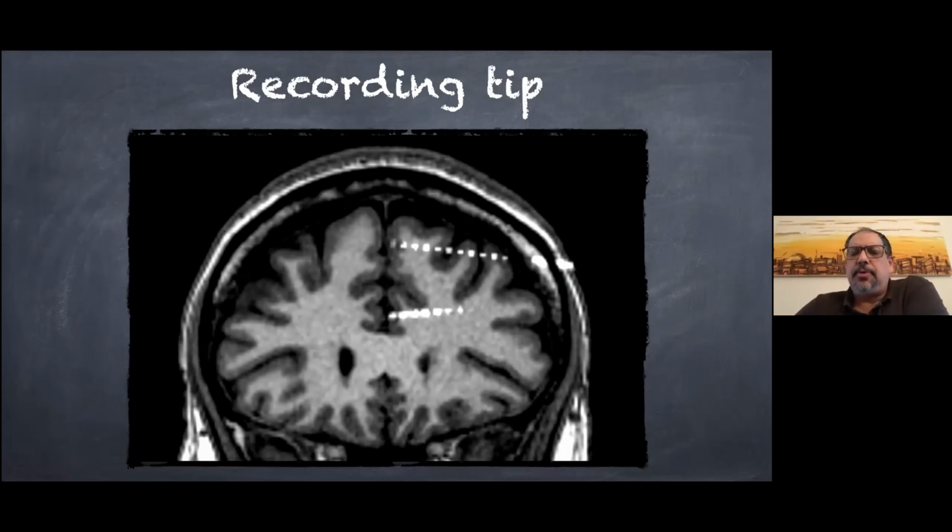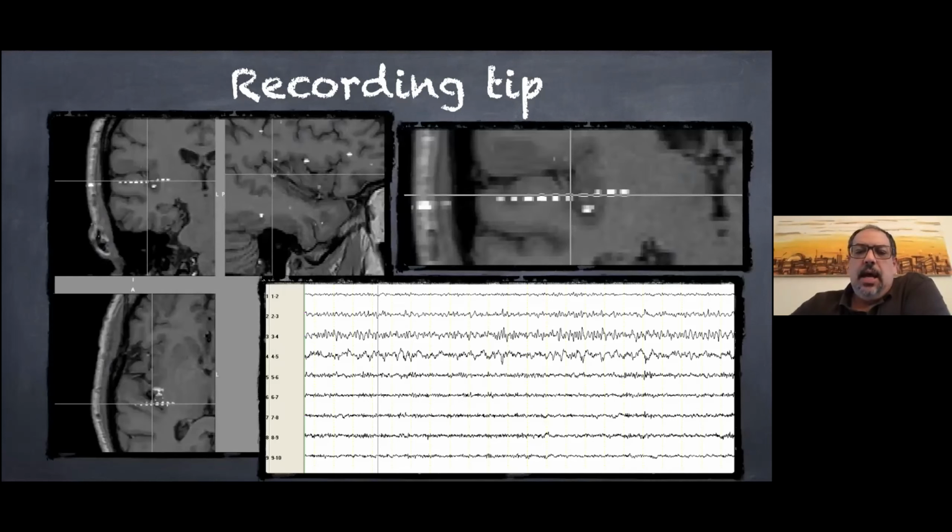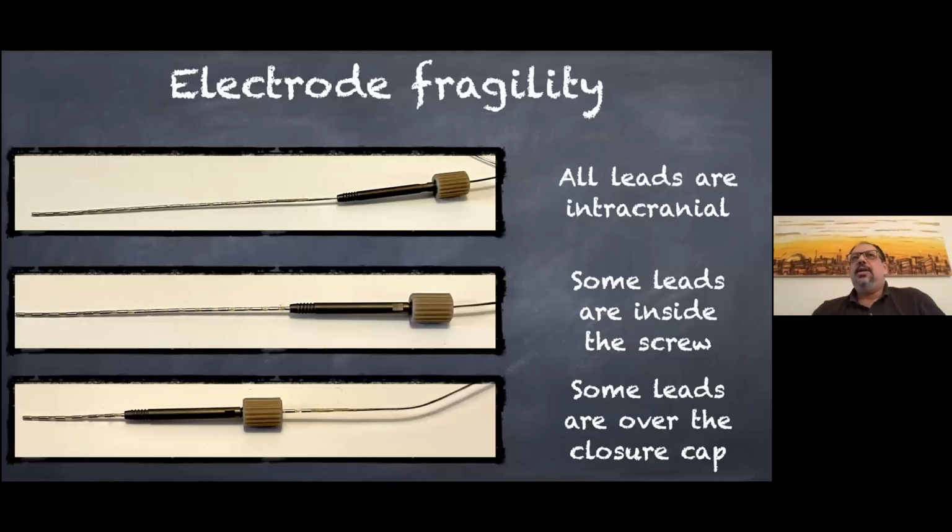We will have the possibility to touch very dangerous arteries, so better not to go over. Also, at the level of the insular cortex, this is the situation. Normally, we prefer to go a bit over the insular cortex in order to have at least one or two traces that give us the pure insular signal without having a mix of insular and opercular cortex signal.